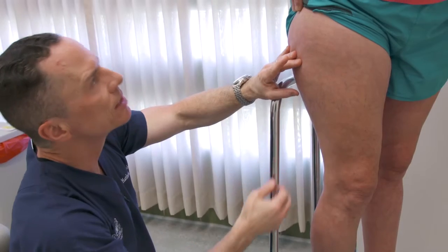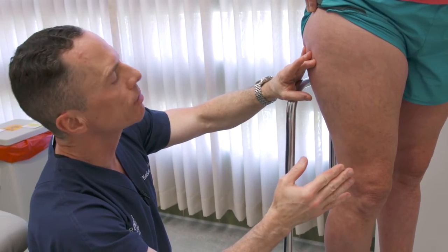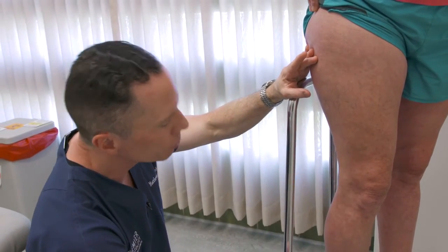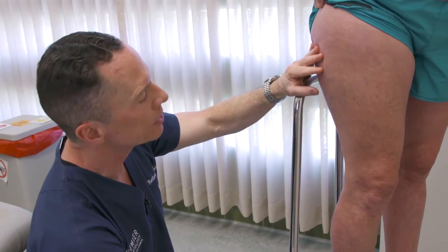So the key element of making this go away is to make the reticular vein go away. And then we're gonna actually go in and specifically treat your spider veins. And collectively, all this will go away. So hopefully in one treatment, we're gonna get you a hundred percent elimination of these spider veins.